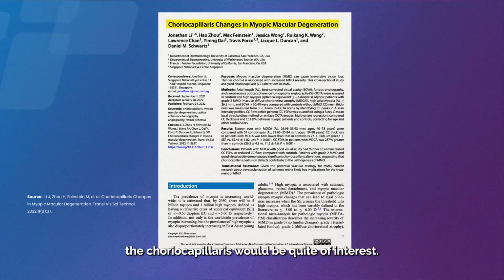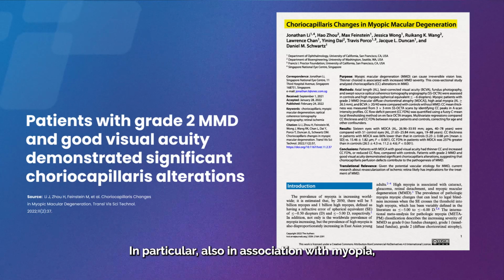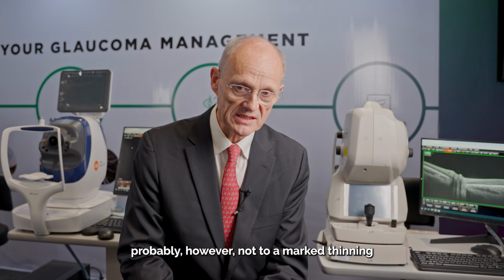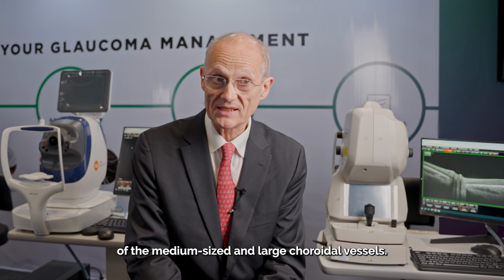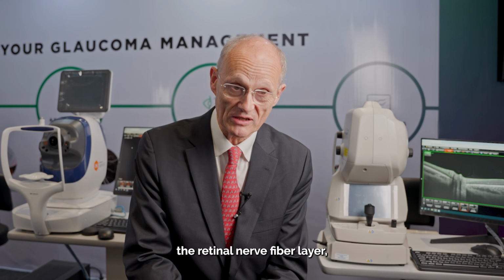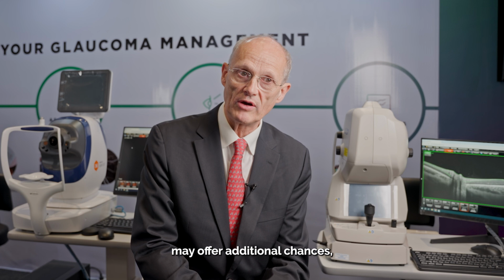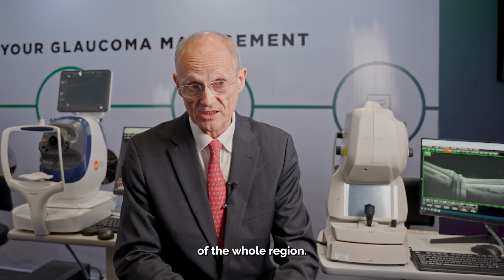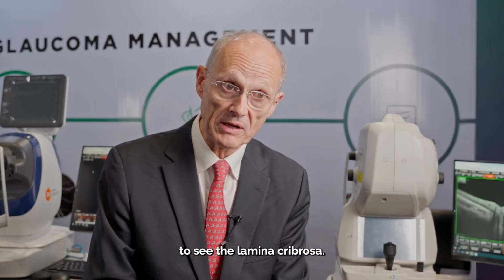In particular, the choriocapillaris would be of quite some interest, especially in association with myopia, because myopia leads to a thinning of the choroid, probably, however, not to a marked thinning of the choriocapillaris, but preferentially of the layer of the medium-sized and large choroidal vessels. If one now goes to the parapapillary region, where one normally measures the retinal nerve fiber layer, then the deeper penetration of the SS-OCT may offer additional chances to have a better visualization of the whole region. And one may perhaps also have a better chance to see the lamina cribrosa.